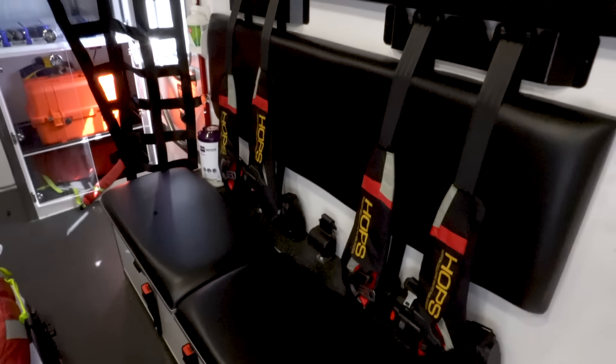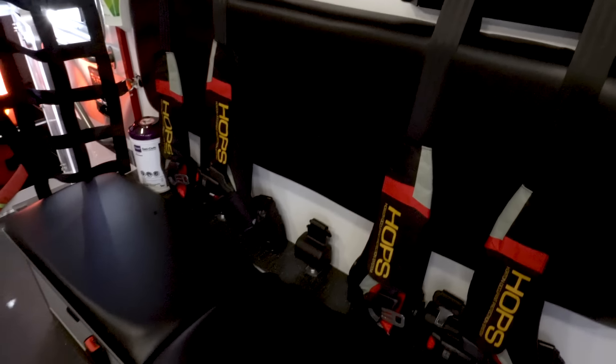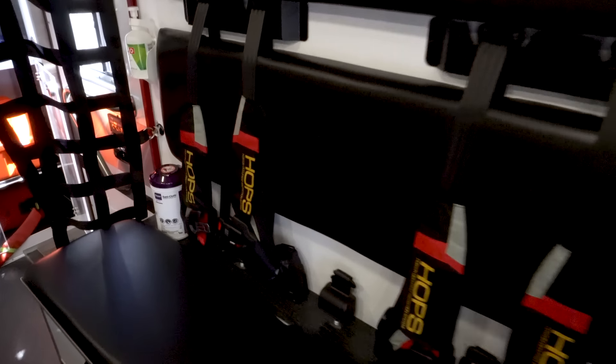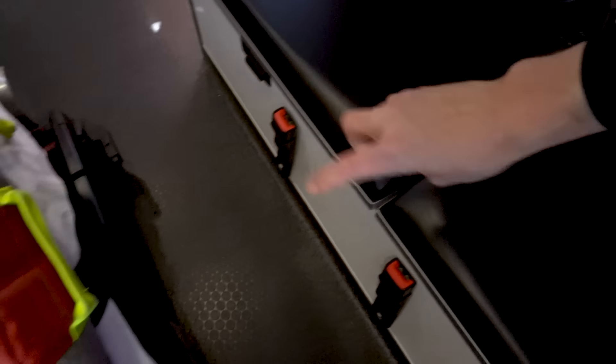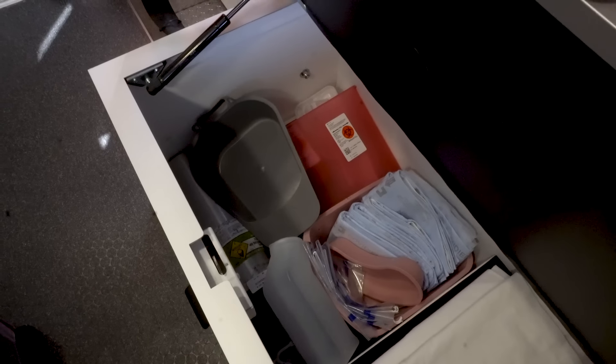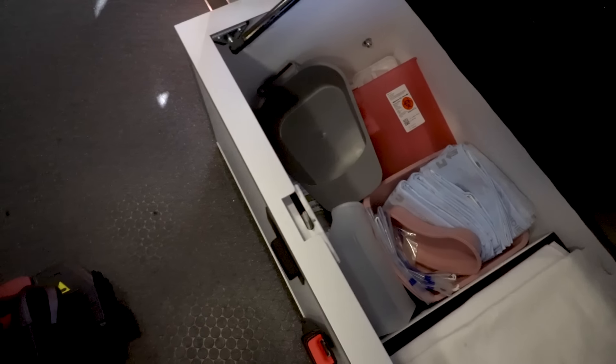Coming to the side here, we've got our bench seat. There are two large straps here — you can actually strap a backboard or a patient lying supine here with these seat belts, which is a cool feature. No cabinets up here. In these seats, we've got sanny cloths, linens in one, and kind of our miscellaneous in another: body bags, an O2 tank, chucks, urinals, and things like that — just there so if you need them, you can grab them quickly.